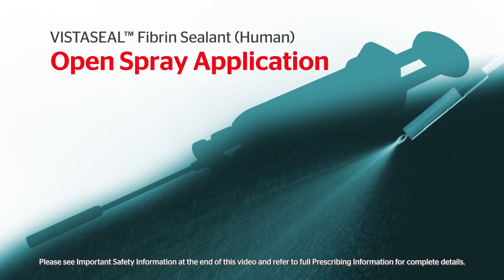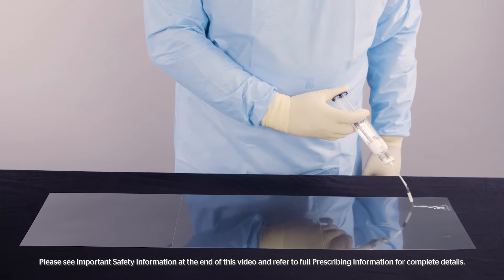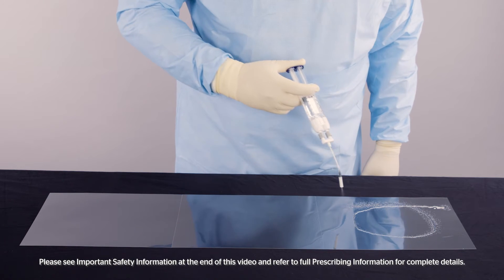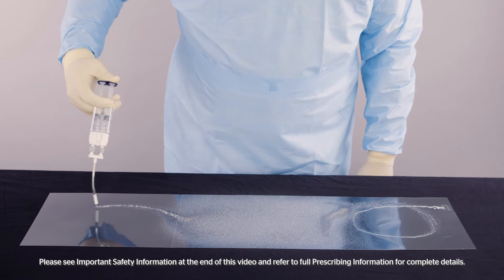VistaSeal can also be applied using a spray method. Position the airless spray tip two centimeters or more from the target tissue. Apply firm, even pressure to the plunger to spray the fibrin sealant. Increase distance accordingly to achieve desired coverage of the target area. Note that the tip can clog if continuous pressure is not maintained.